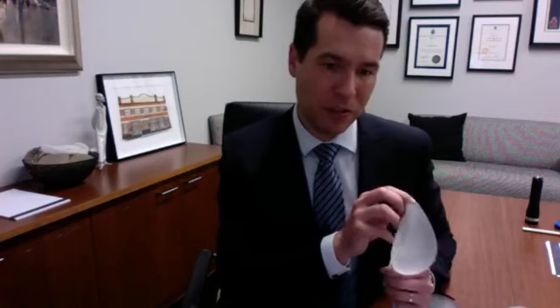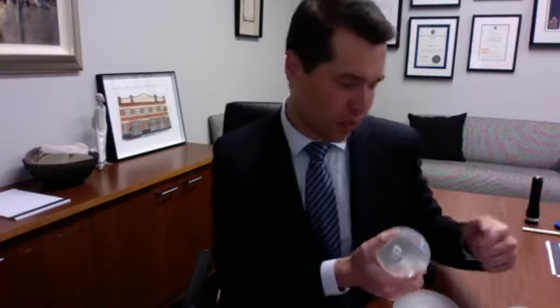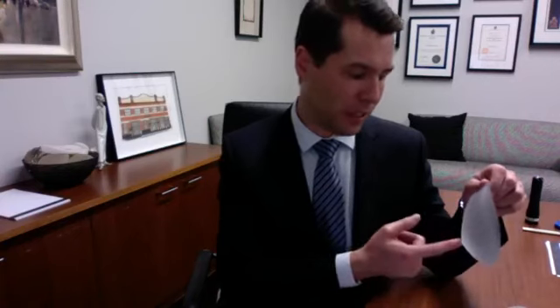So that's a new device, the anatomical Motiva TrueFix nano-textured surface. It's a grade 2 gel in terms of the thickness of gels. So we look at 1, 2, 3, 1 being the softest. A number of you would be aware of the Motiva Ergonomics implant, which is their sort of hybrid type implant. It's been marketed as a gel that moves within the implant. So it rolls, forming a natural flat shape when you're lying down, and then when you stand up, the gel forms an apex point, which is 45% of the way up from the base, 55% of the way down, which is pretty similar to what we see with a teardrop shaped implant.